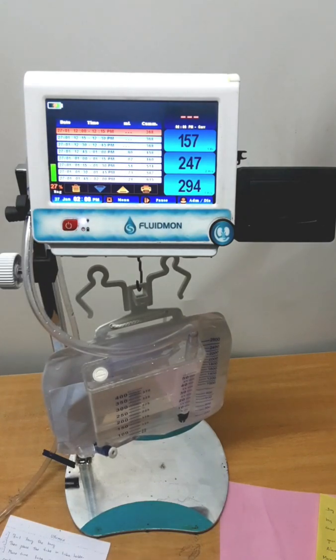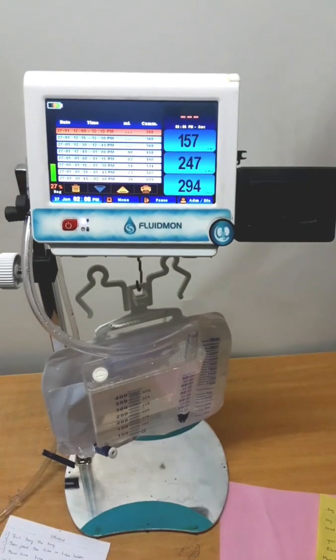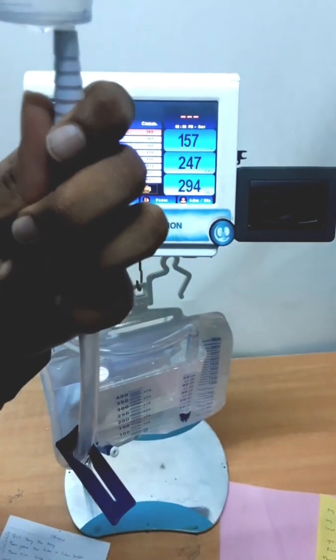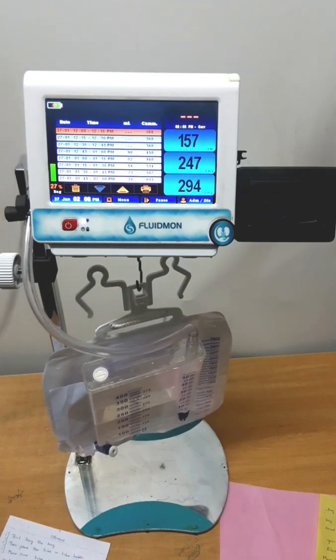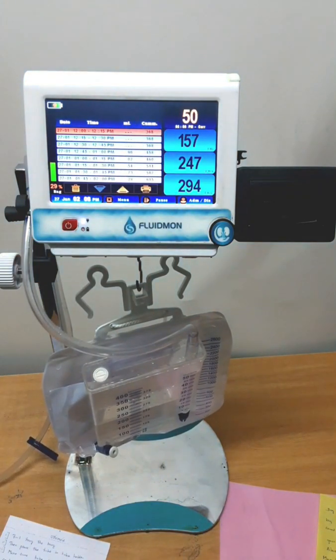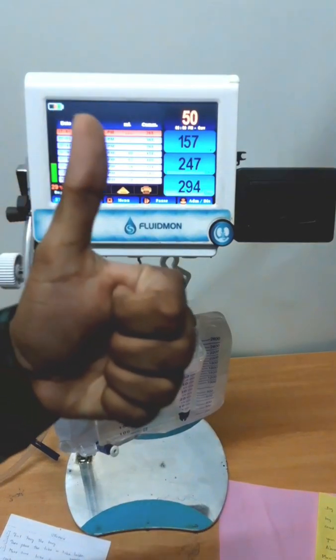For an accuracy test, I am going to pour 50 ml of water into this bag. Now let's see what happens. 50 ml is poured into the bag. Now see the value of the current interval — it changes to 50 ml. The accuracy is 100%.